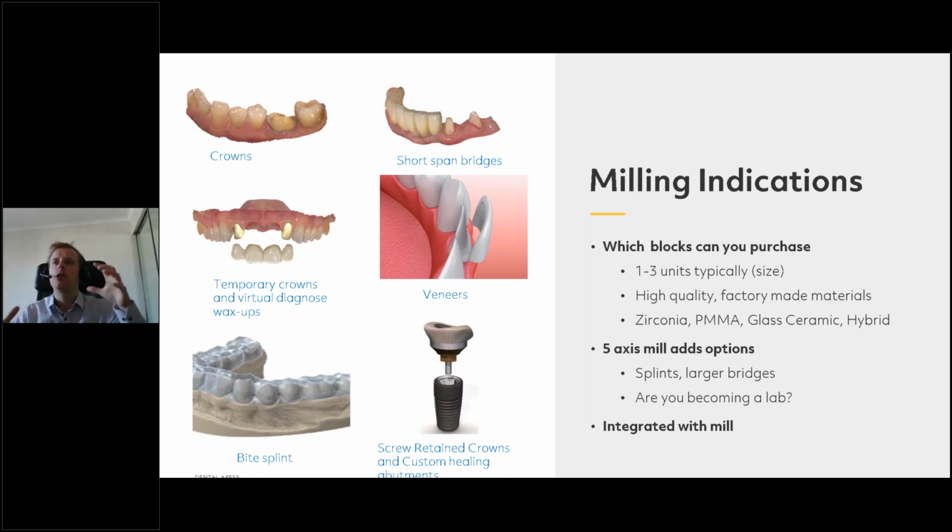You need to have an iso press. Similar with PMMA, you could mix up some acrylic and pour it in, but it's not going to be dense. You need a big machine to force the PMMA and make it really dense and really strong. I haven't seen a quick YouTube video on how to make my own glass ceramic. Neither have I seen a glass loaded hybrid material.